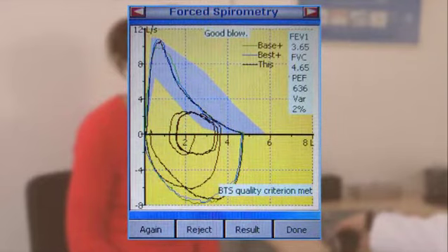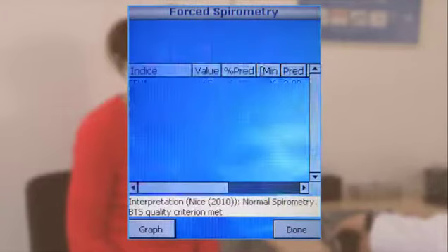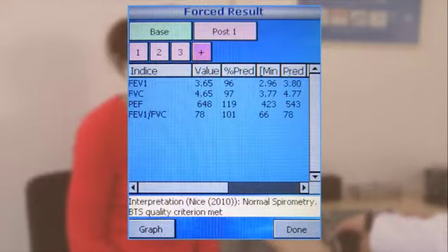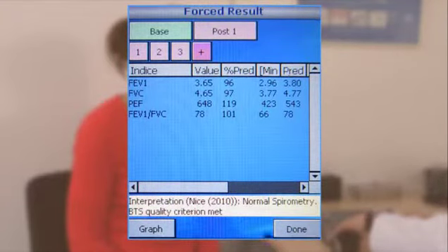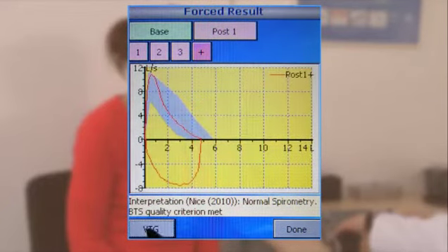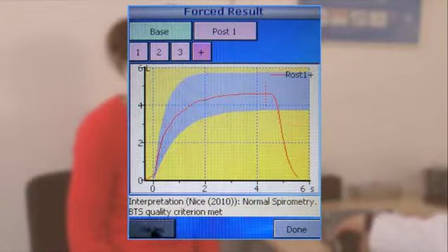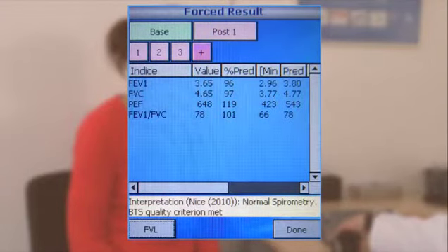The results of all blows contained can be viewed once the post-test has been completed. Here you can compare the results of blows before and after medication. Touch the numbered boxes to select a blow. Each blow can be viewed as values or graphs.